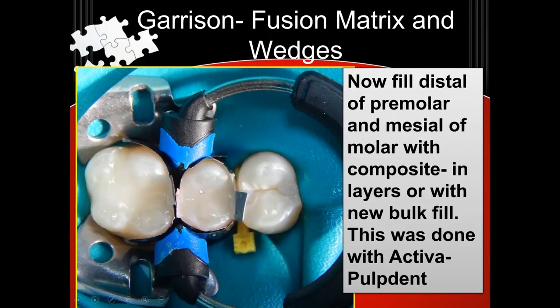Then I'll move the bi-tine ring in between the molar and the premolar — just takes about 10 seconds. And then I'll fill the distal, light cure that, then fill the mesial, and light cure that. Now you could do this with any bulk fill. What you do is you've pushed — you push this that way to make it tighter and open this up more. So you open this up, completely put this in, cure it so that shrinks, and they push this out a little bit more. I'm pushing it out 0.112 millimeters, but I'm getting it out nice and tight. So all these are going to be nice and tight — that's the whole idea.